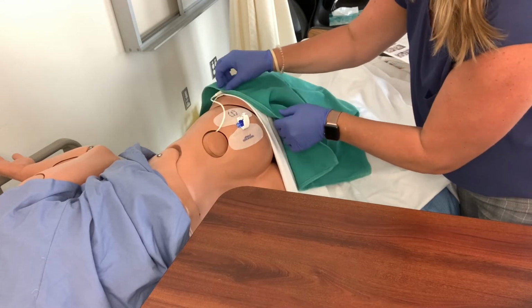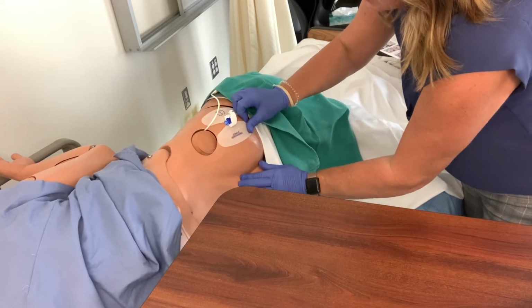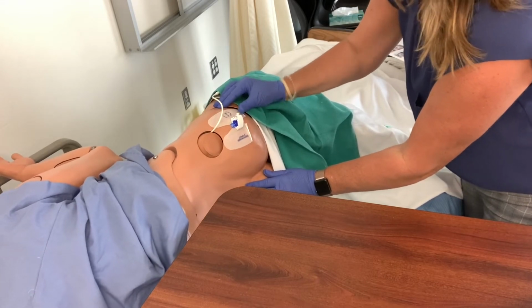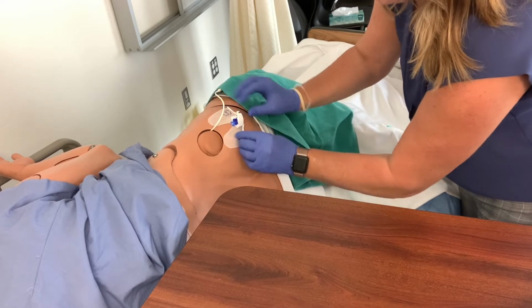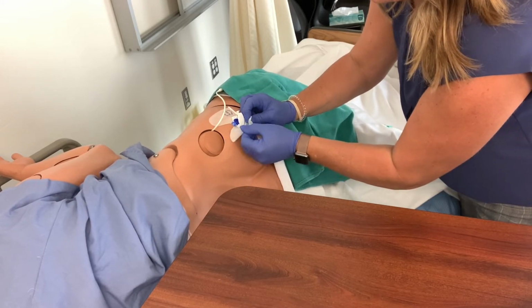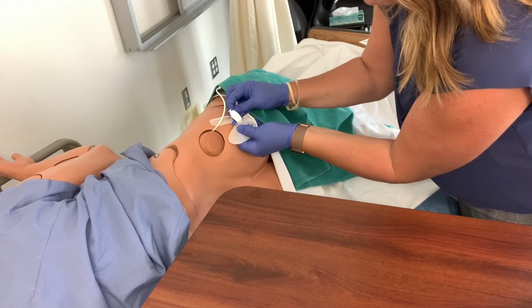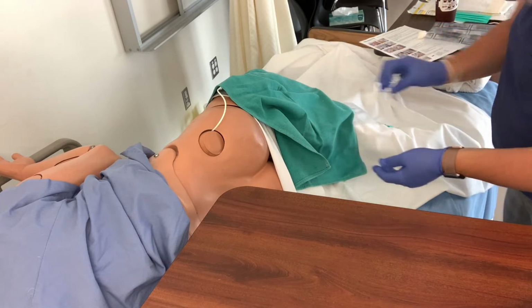I'm using the towel to help hold where I want that catheter so I can see it. And if you just rub with your finger, you at least get something to half hang on to. Believe me, this sticks fairly well on most people, so you just want to make sure that you don't cause any skin tears when you're removing it, so be extra careful. So the StatLock has now been removed.